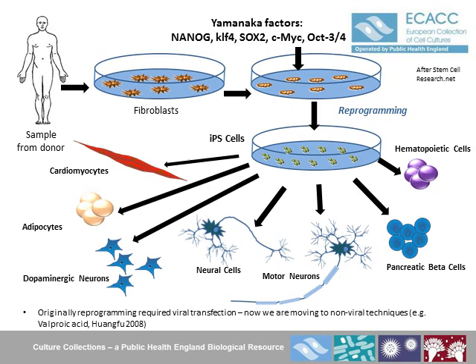iPSC techniques are being rapidly developed. Originally, the transcriptional regulators had to be introduced by viral vectors, but novel virus-free techniques are being developed, such as reprogramming using valproic acid.